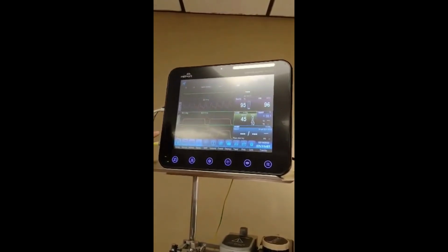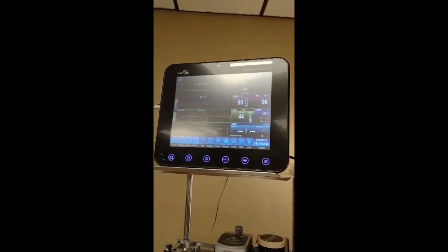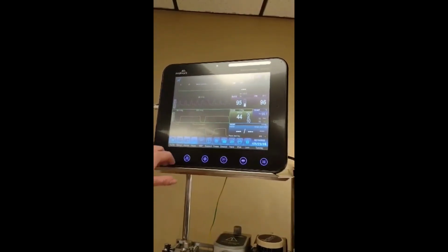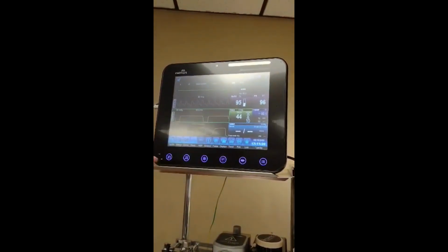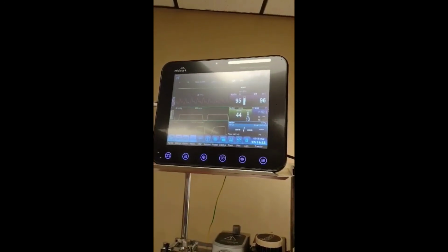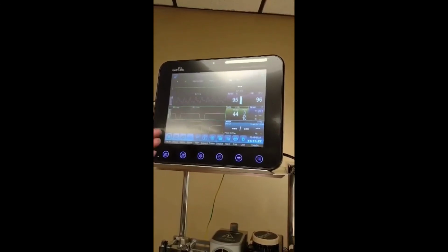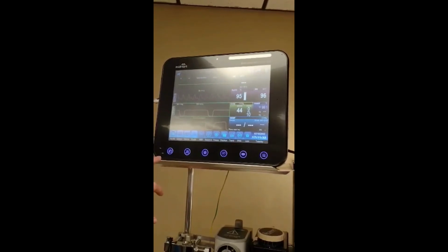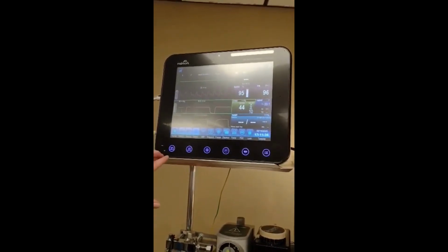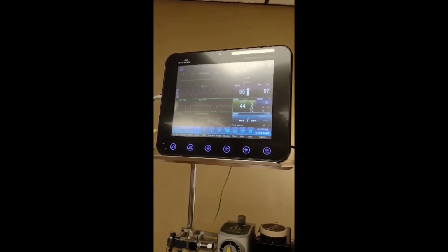The other really interesting and important thing about our capnogram is that we are generally going to see the very first sign of a return of spontaneous circulation reflected in our end tidal. So we'll have a patient that we're hopefully doing really good compressions on start around a 20. If we suddenly spike to a 35 or a 45, that may be our very first sign that our patient has started that return of spontaneous circulation, or circulating on their own and not necessarily needing us to do it for them. That's it.